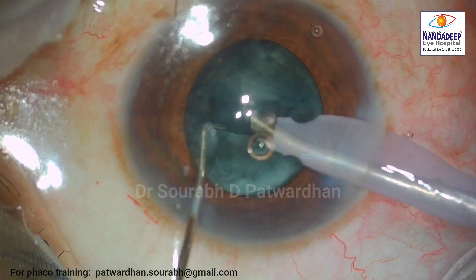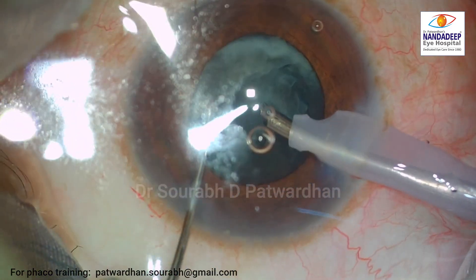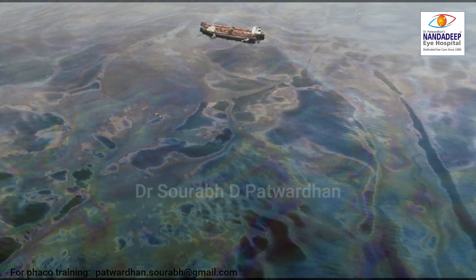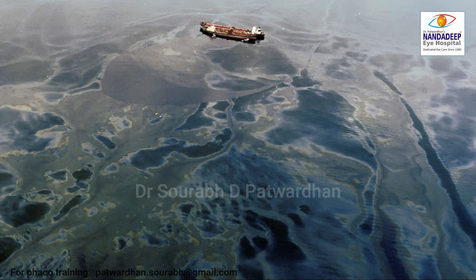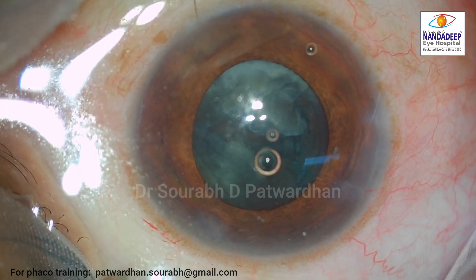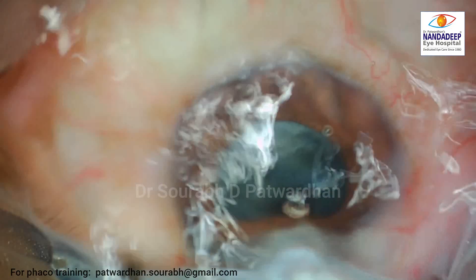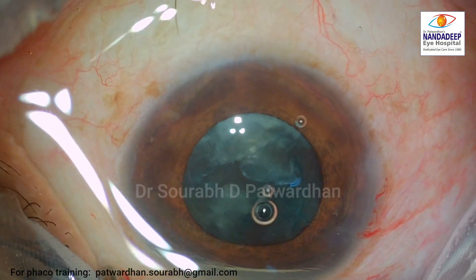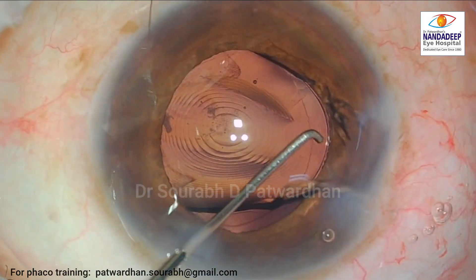I am avoiding flushing it off by the assistant because I don't want to create any splatter. It looks exactly like oil lying over a water surface. I know these are the meibomian gland secretions, and this patient probably has some meibomian gland disease which has led to the release of so many secretions on the ocular surface.